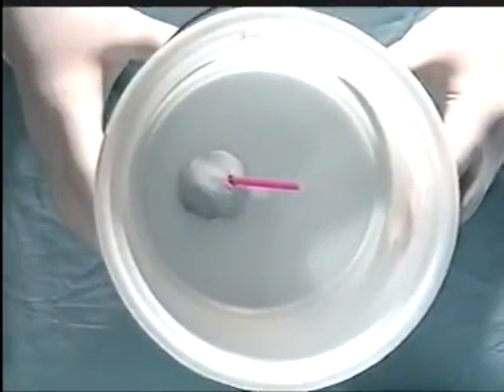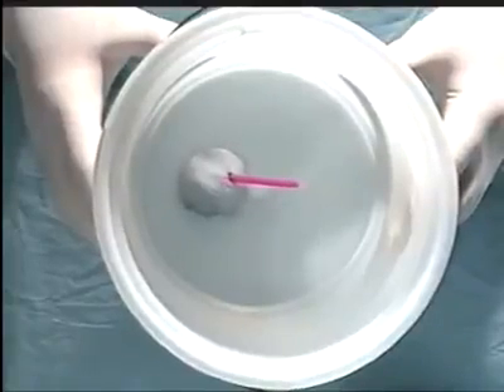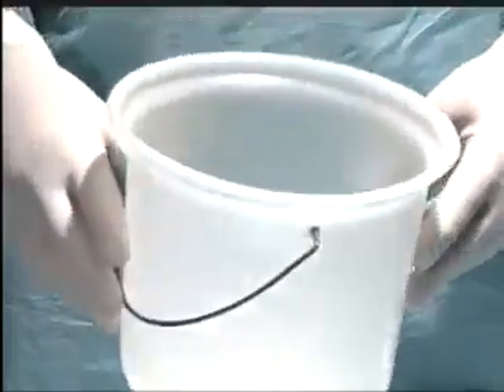Let's look at a model for tying a depth in the pelvis. You see here a simulation of a small blood vessel deep in the pelvis, coming made from a straw and a blob of blu-tack.